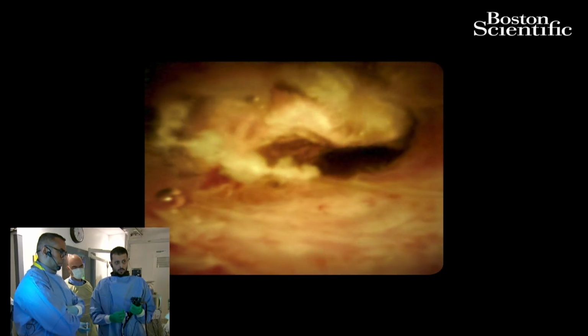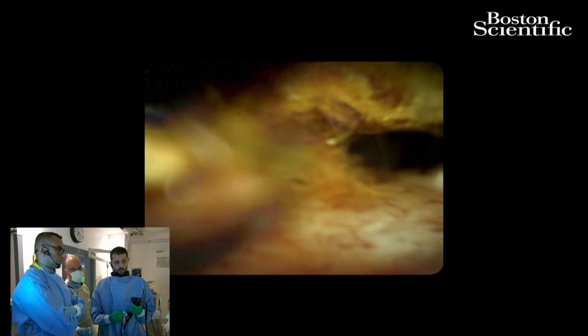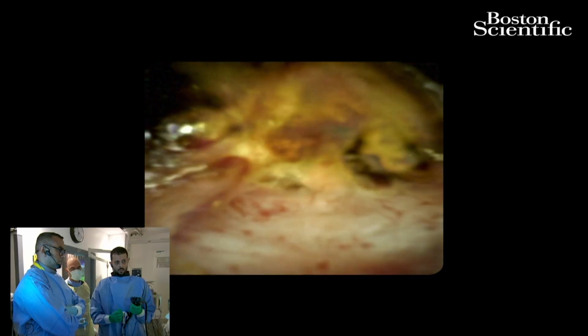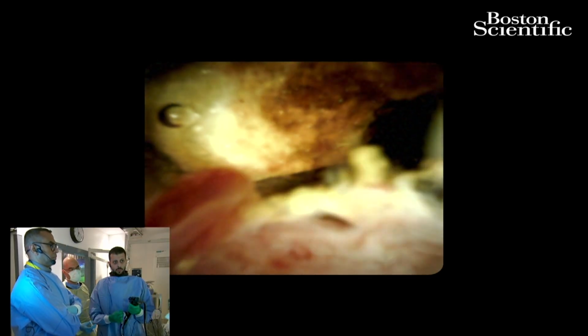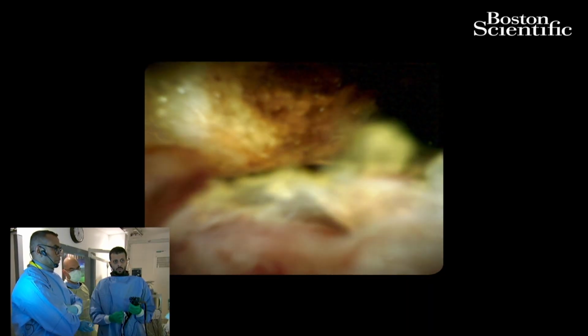Unfortunately, we know that cholangiocarcinoma is indolent and subepithelial. So usually when you see a stricture in the CBD, like this patient, he has a mid-CBD stricture, that's the best patient to send to surgery because it's only a hepaticojejunostomy. He's not in the distal or perihilar area.